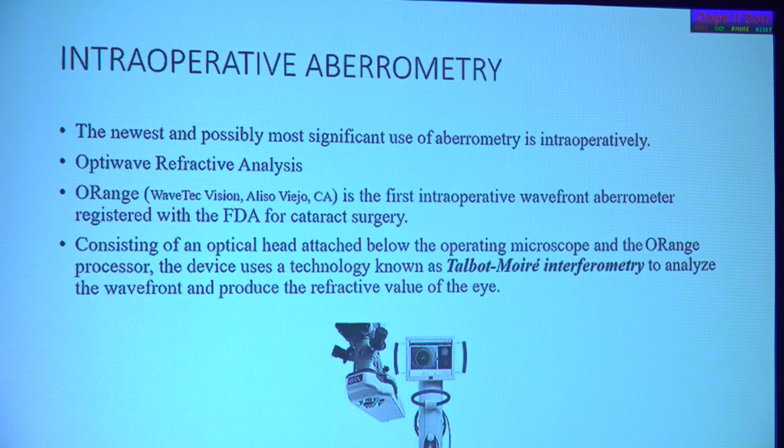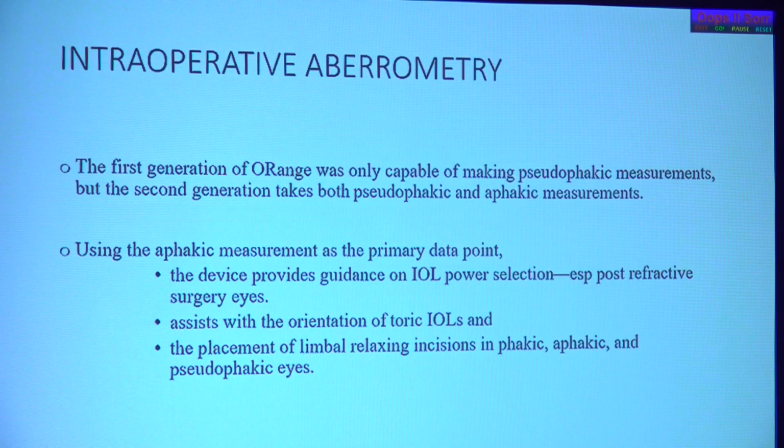And the most important thing is intraoperative aberrometry, which is the advanced innovation happening now, and which can be attached to any of the microscopes. It can do measurement in both the pseudophakic and aphakic states. Using the aphakic measurement as a primary data point, the device provides guidance on IOL power selection, especially in post-refractive surgery eyes.